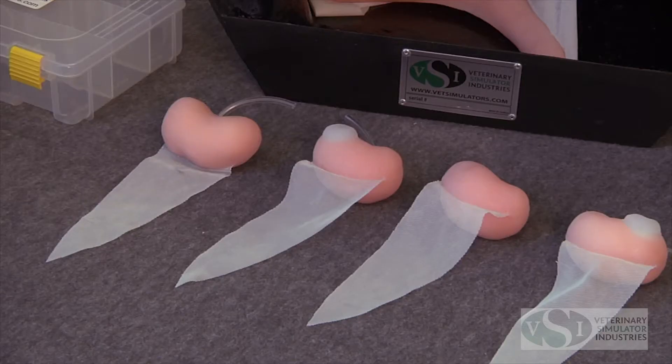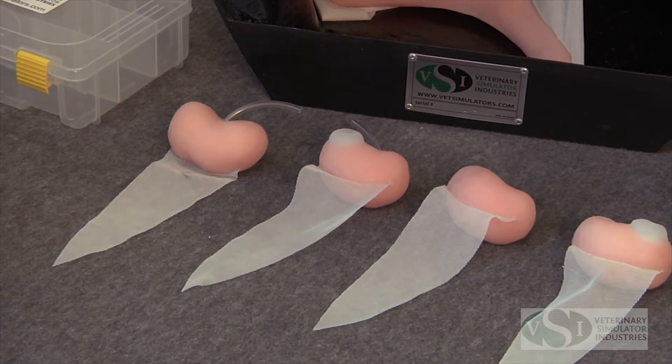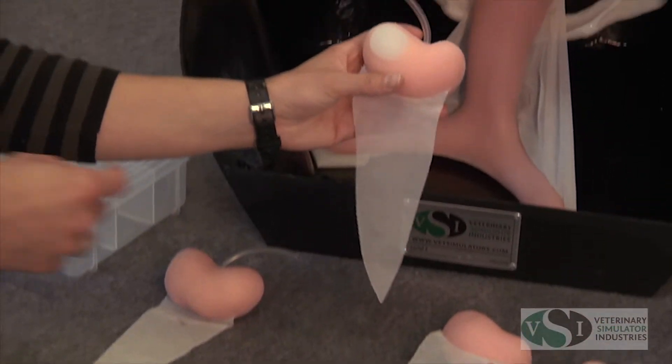The model comes with the VSI Equine ovary set which includes three sets of ovaries: anestrus, estrus, and estrus with follicles, with a plastic case for easy storage. The ovary models are interchangeable and are easily inserted into the uterus horn.